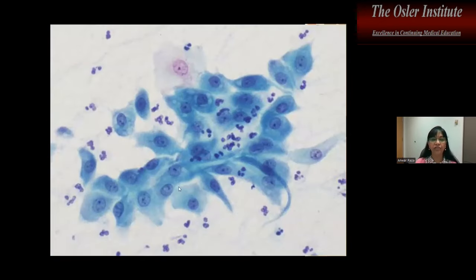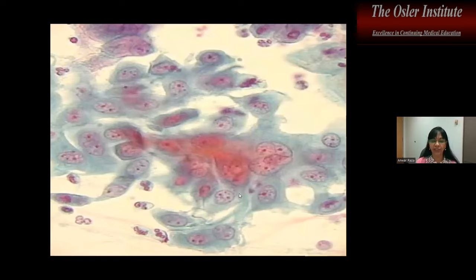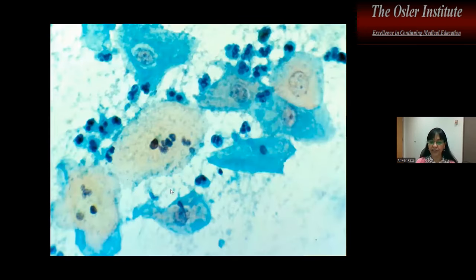Here's inflammation, prominent nucleoli, but very two-dimensional. You don't really see much overlapping, and then sort of wisps coming off from the edges. This would be reactive changes. Again, two-dimensional, maybe a little clustering over here, but again, sort of falling apart at the edges. This is very, very reactive changes.